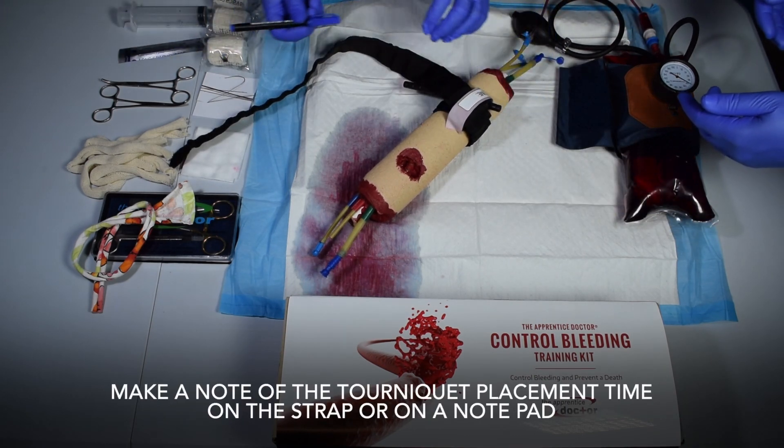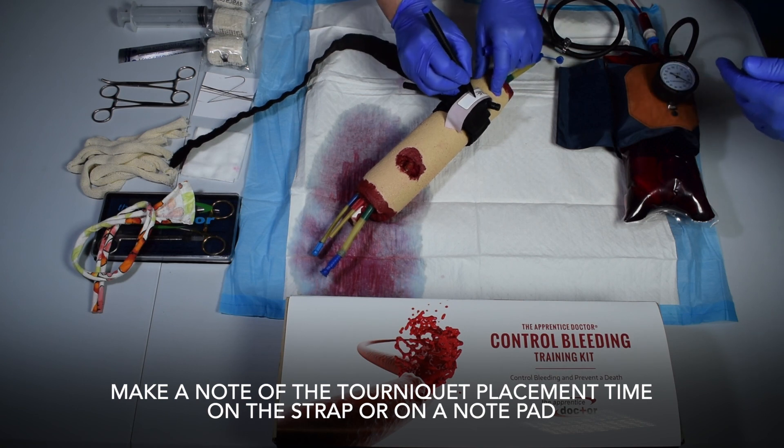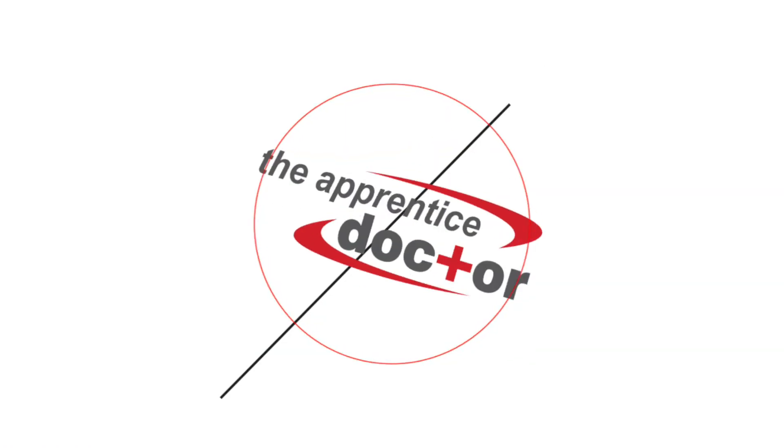Make a note of the tourniquet placement time on the strap or on a notepad.